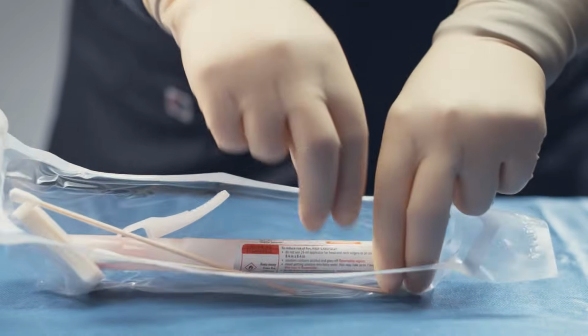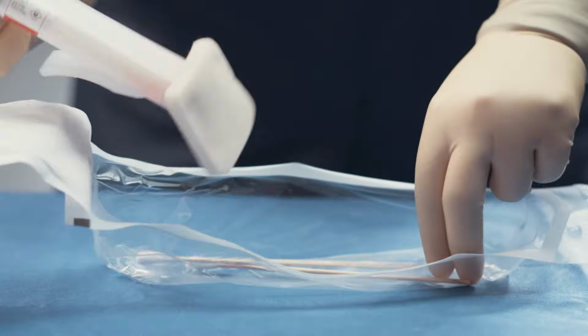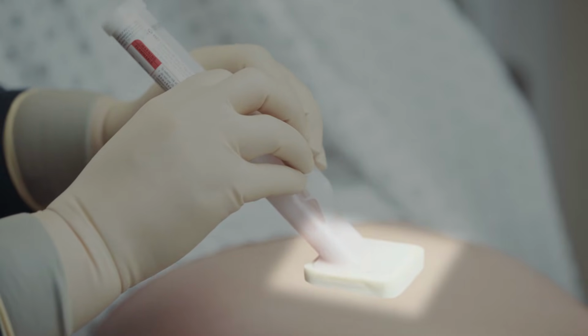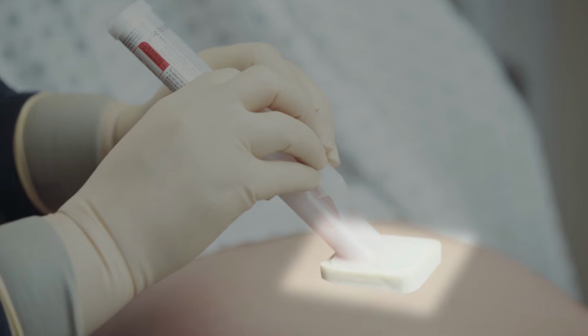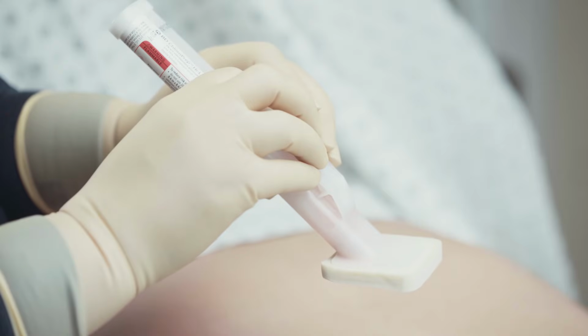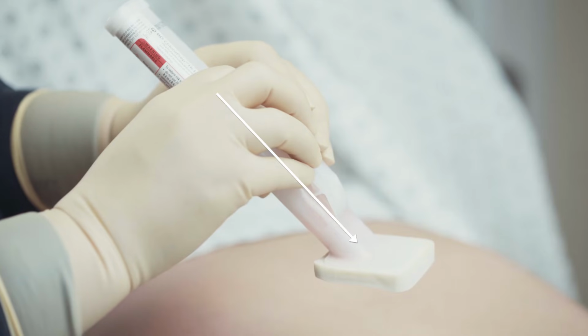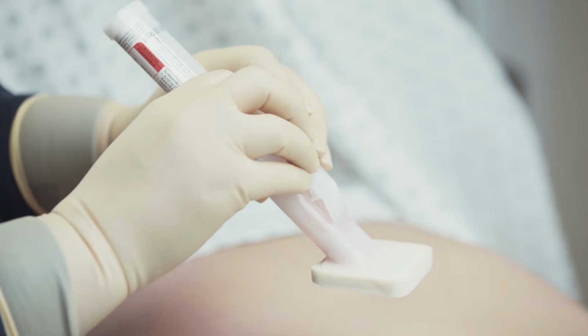To get started, remove the 26 milliliter applicator from its packaging, making sure to practice aseptic technique. Do not touch the sponge. Activate the applicator by holding it with the sponge in a downward position parallel to the ground. This position allows the solution to properly load into the sponge upon activation.